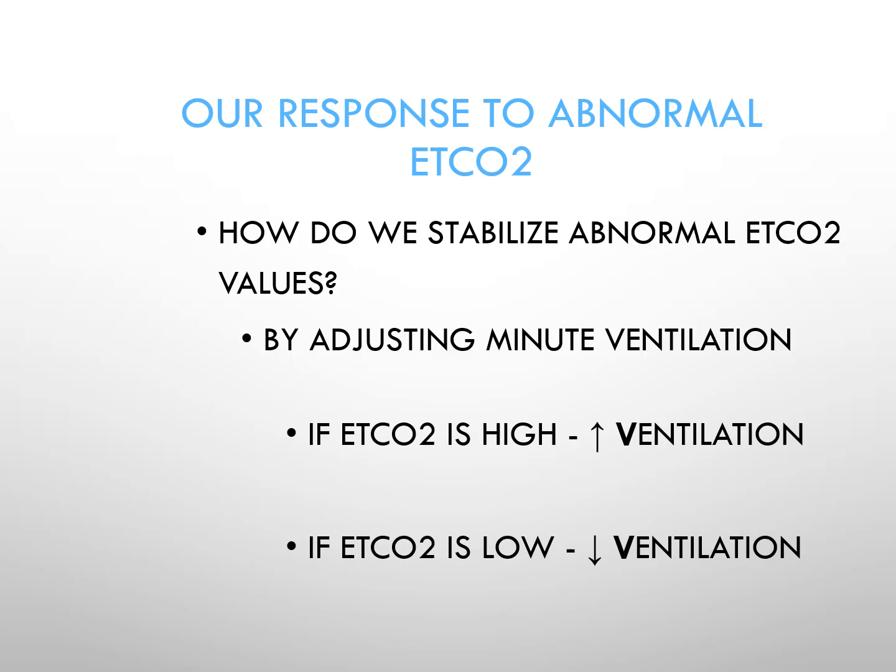Now, if the patient is spontaneously breathing, here's another case. You want to look at the actual underlying cause. They may be breathing quickly because they need to compensate for a metabolic acidosis. So the end-tidal CO2 may be low, but they may be in a diabetic ketoacidosis. If that is the case, then the team needs to actually treat the DKA, the diabetic ketoacidosis, or the other form of metabolic acidosis.